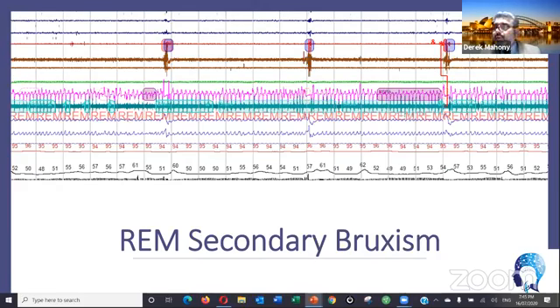It's a bit like if you send your patient to a medical radiologist for an OPG, what does your report say? Teeth are present normally, or something, really amazing. Whereas if a maxillofacial radiologist reads it, he's going to say, right, Eagle syndrome, possible caries on the 4-6, blah, blah, blah. It's a dental medical thing. So if you get someone from a dental background who's also a sleep scientist like yourself reading this from a dentist's mind, you're picking up stuff that I find very, very useful.